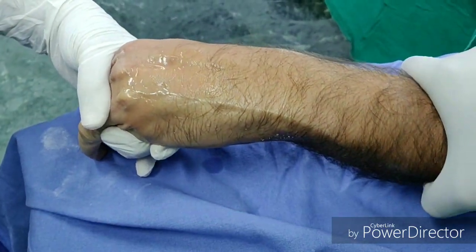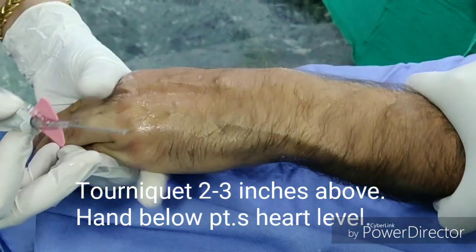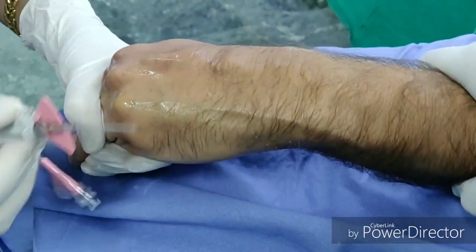Disinfect the site with alcohol and wear sterile gloves. Keep the IV cannula sterile, making sure its tip does not touch anywhere. Gently tap on the vein to make it more prominent.